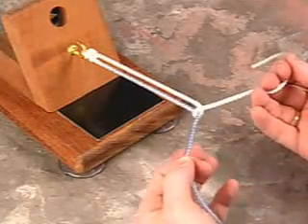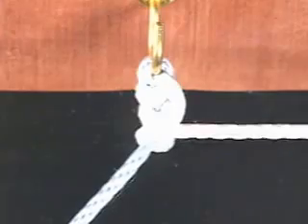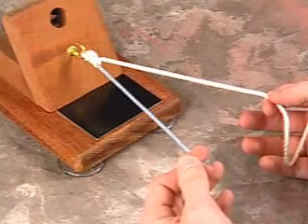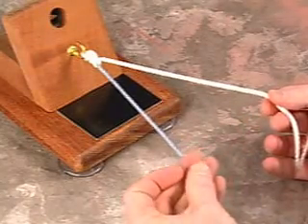The next half hitch is an overhand throw, and again this is introduced into the joint. At this point, you still have a sliding knot, although it is very difficult for this knot to slide.